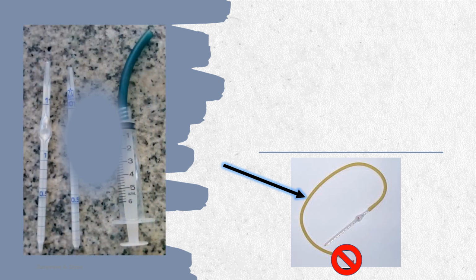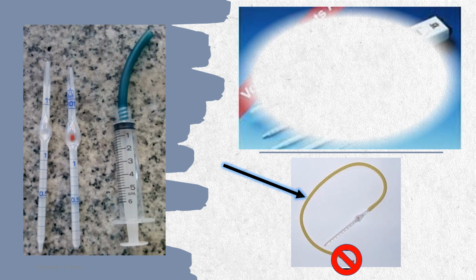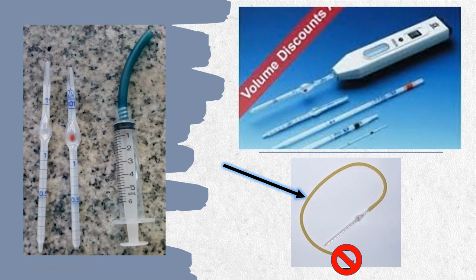The Thoma pipettes are connected to a rubber tubing used for aspirating blood and the diluting fluid. This was initially meant for mouth aspiration, which is no longer practiced due to the hazards it brings. Instead, a rubber tubing was connected to a syringe to facilitate aspiration. But nowadays, automatic aspirators are connected to the pipettes that give a more accurate aspiration.